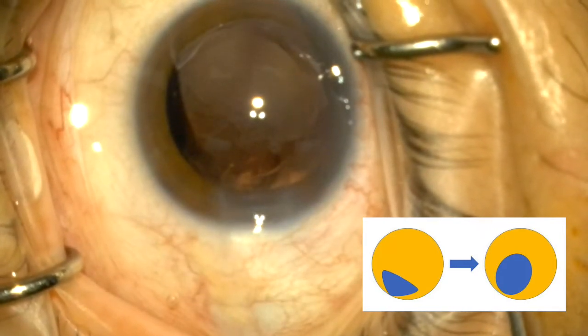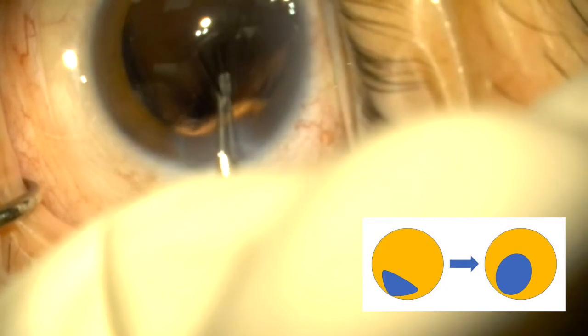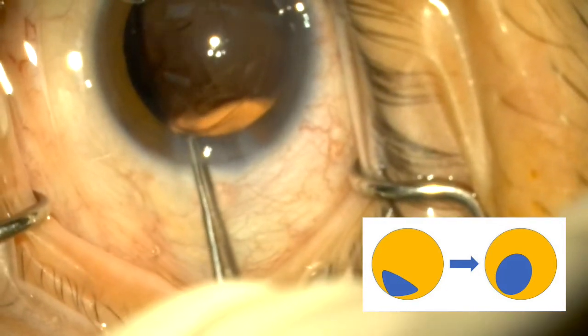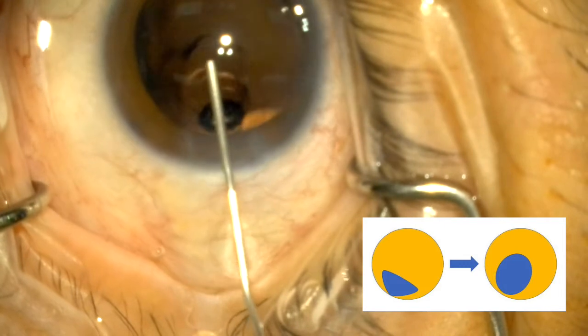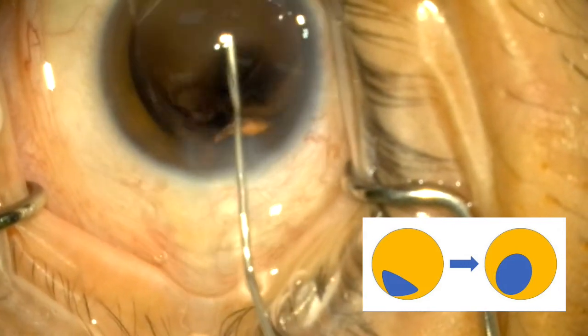I use a standard Utrata to extend my PC rent into a standard posterior CCC. It is inevitable that some of the vitreous may be pulled out into the anterior chamber while you pull out the posterior capsule. Hence, you need to inject viscoelastic to tamponade the vitreous back into the posterior chamber.